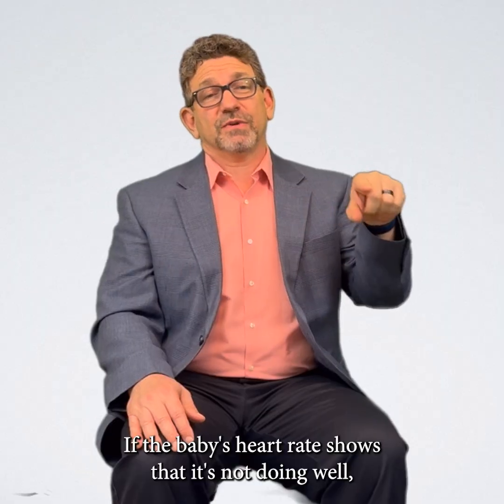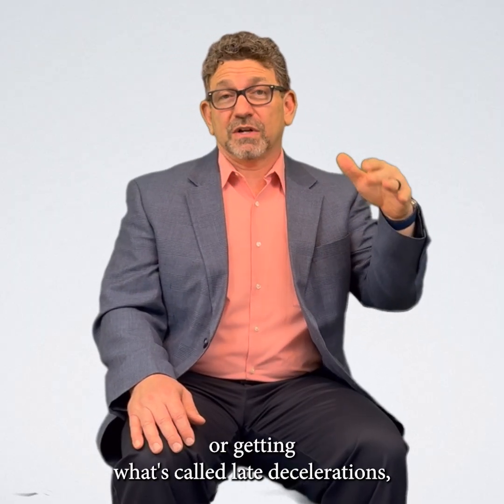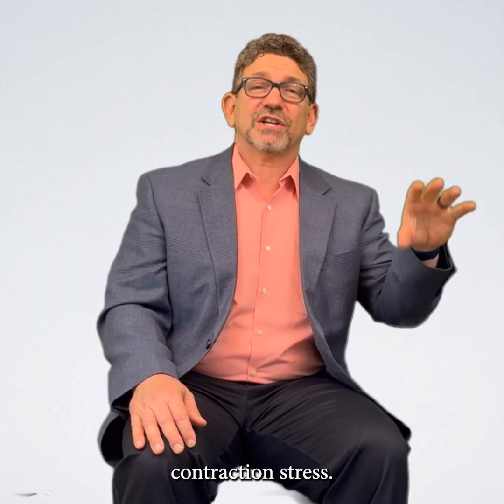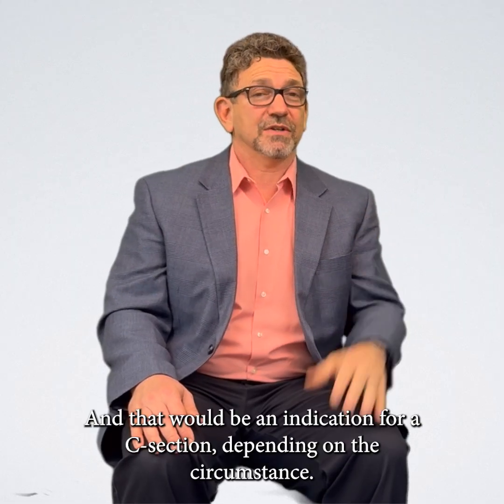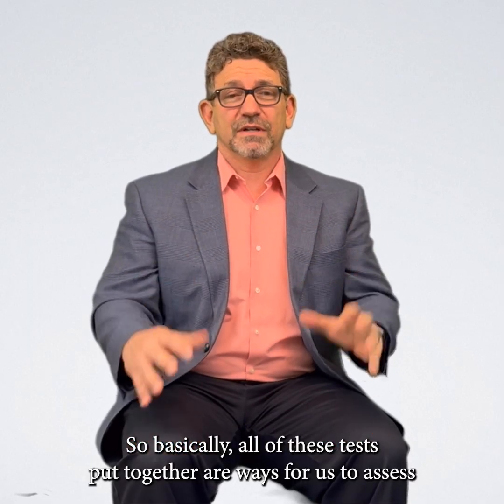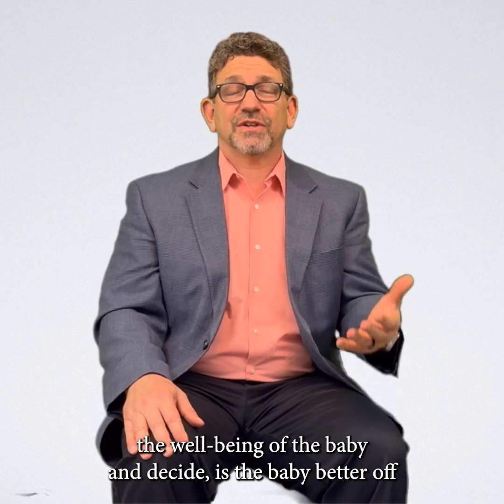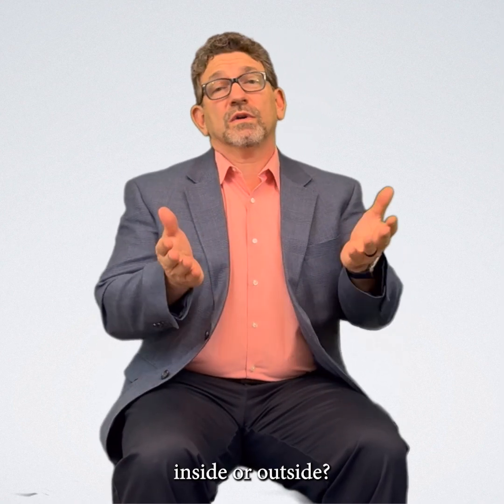If the baby's heart rate shows that it's not doing well or getting what's called late decelerations, that would be a positive contraction stress test, also called an oxytocin challenge test, and that would be an indication for a C-section, depending on the circumstance. So basically, all of these tests put together are ways for us to assess the well-being of the baby and decide, is the baby better off inside or outside?